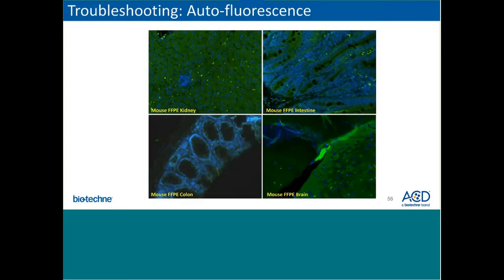One known issue with the fluorescent assay is that due to the long fixation time, FFPE samples are prone to inherent autofluorescence, which poses a challenge for image analysis. If you use FFPE, if you have background correction software, this can help to reduce the autofluorescence. But alternatively, we now have developed the multiplex fluorescent V2 assay, which helps to address this issue. If you are still experiencing autofluorescence issues with your assay, please do contact technical support.